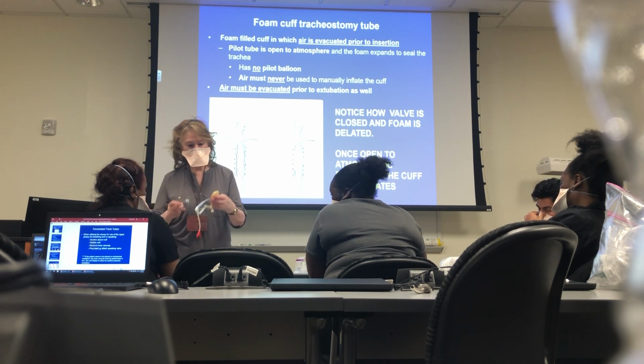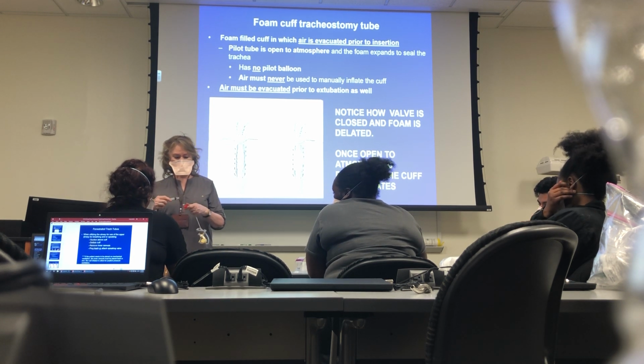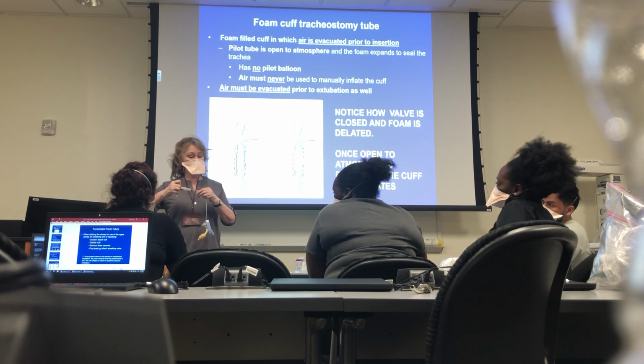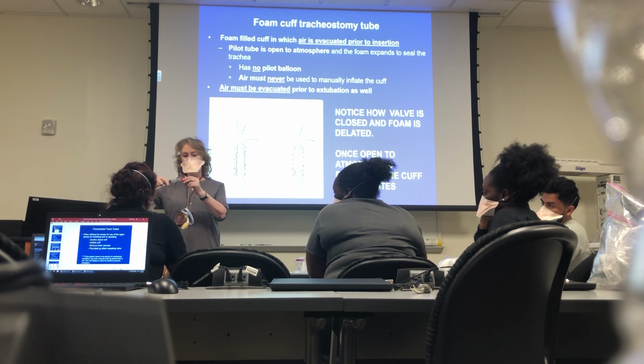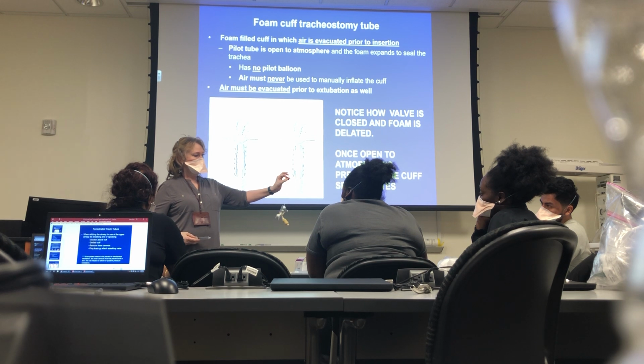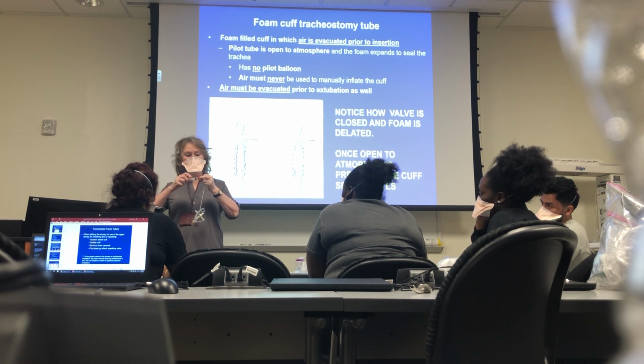So this one, same thing. So with foam cuffs, you're less of a chance of causing any tracheal trauma. Now what I have to do is, as soon as I pull this off, I have to squeeze this, or it'll start to inflate again, okay? I'll let you guys try it. Because if you don't squeeze it, it's open to atmospheric pressure.